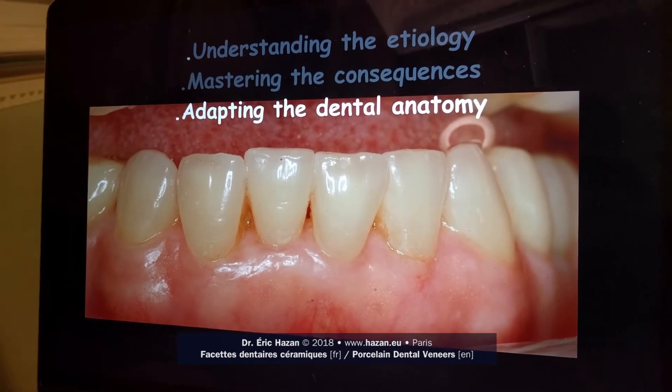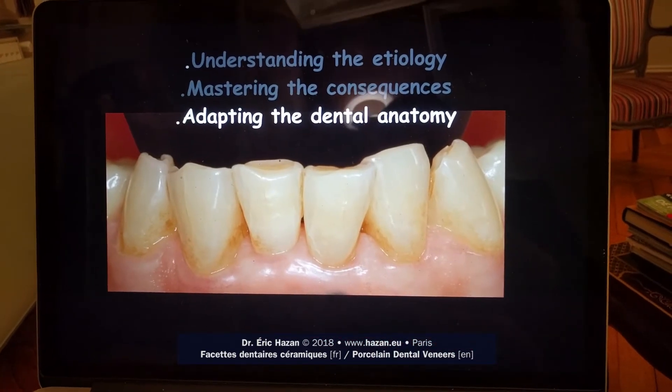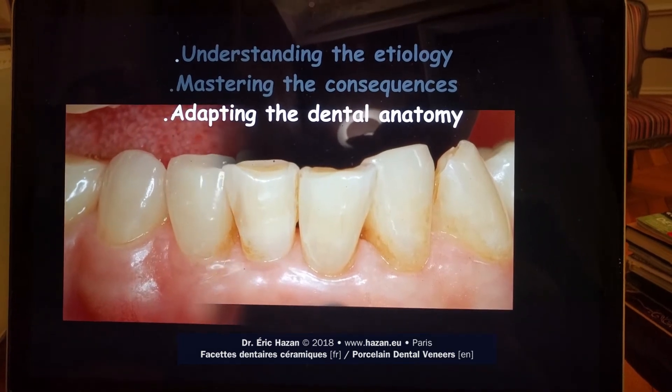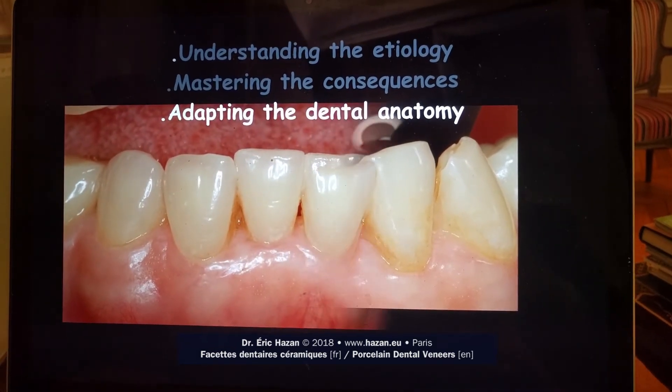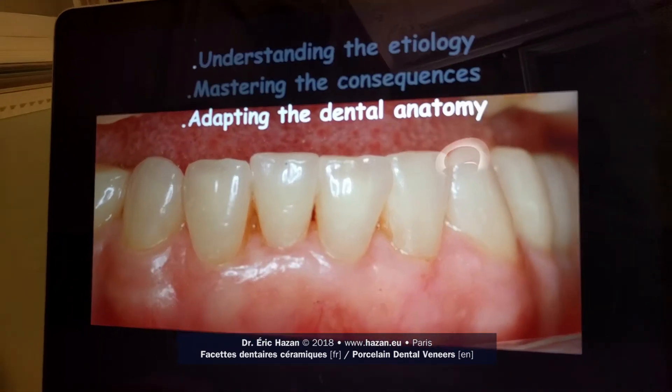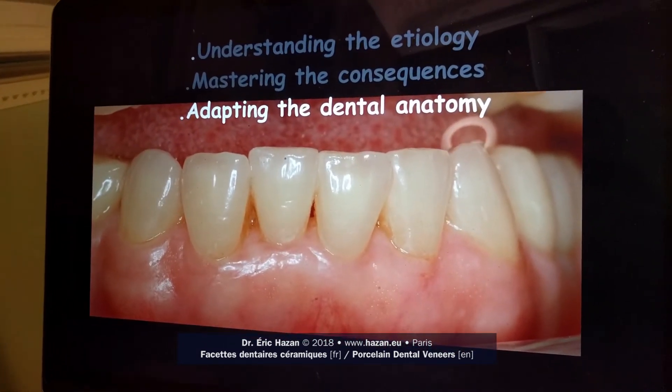We're going to use porcelain laminate veneers — feldspathic porcelain laminate veneers — which will be baked on a refractory die and then bonded, so we will be able to restore the coat of enamel on each tooth.